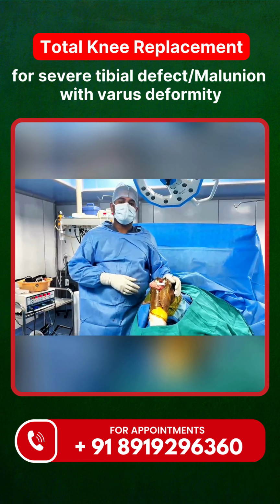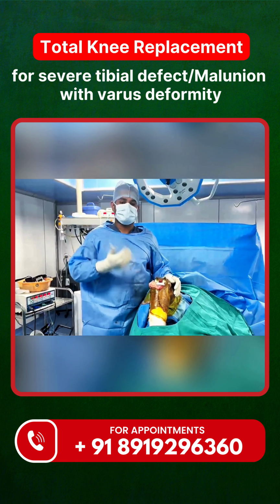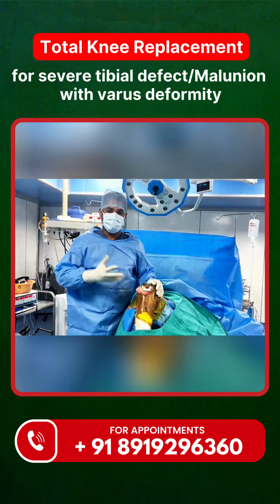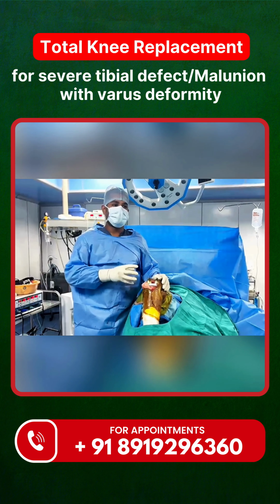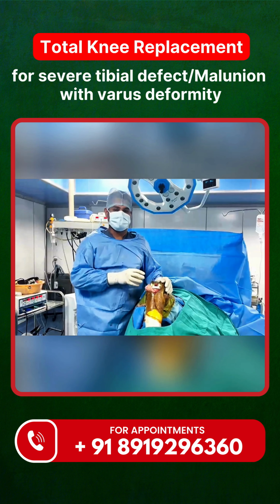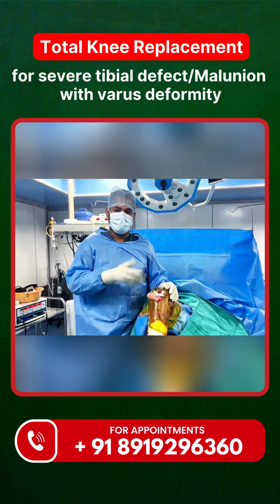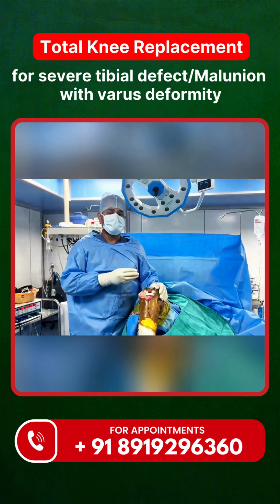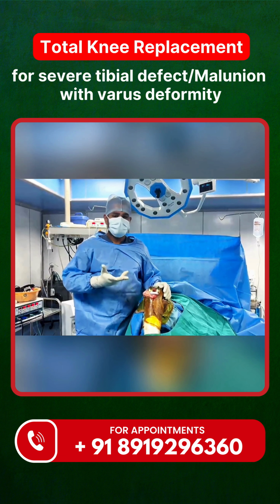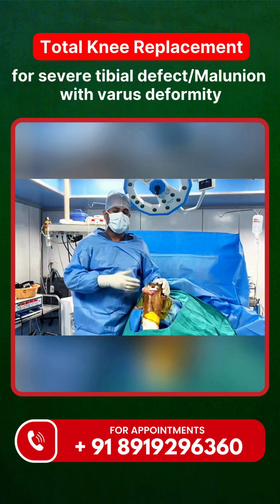Now she came to me with severe pain and inability to bear weight on her leg and reduced range of movement. So we took her up for surgery today. I have explained to her the need for total knee replacement because the proximal tibia is malunited. She has severe arthritis of both knees, mainly the right knee because of the trauma, that is post-traumatic arthritis, and the proximal tibia was completely displaced, medially and distally, and there was severe varus deformity because of the displaced proximal tibia fracture. So we took her up for surgery.